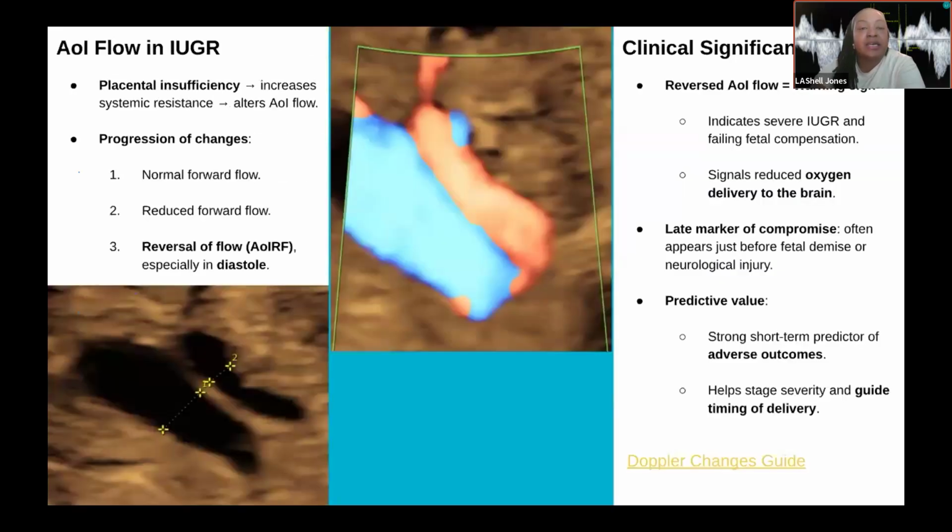All right, now once again, if you notice that there's reversal, that is usually not good. Okay, so before we even get to the color, you want to assess the size of the vessel, which we can see is narrow. Once you apply the color, we notice that there is some reversal. That's usually a warning sign.